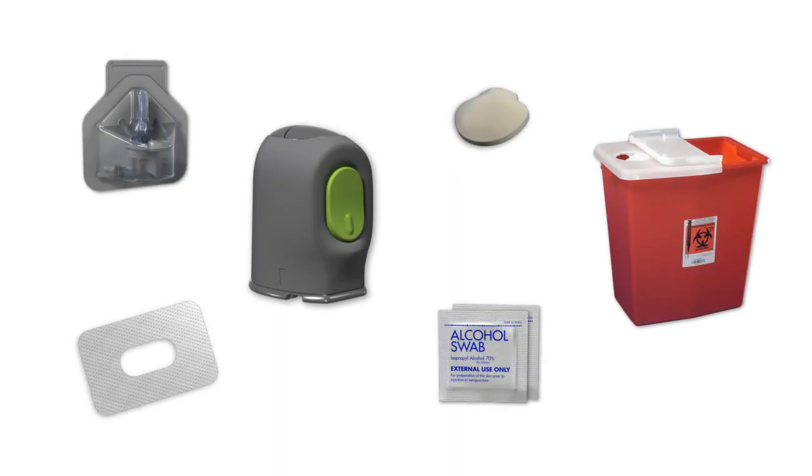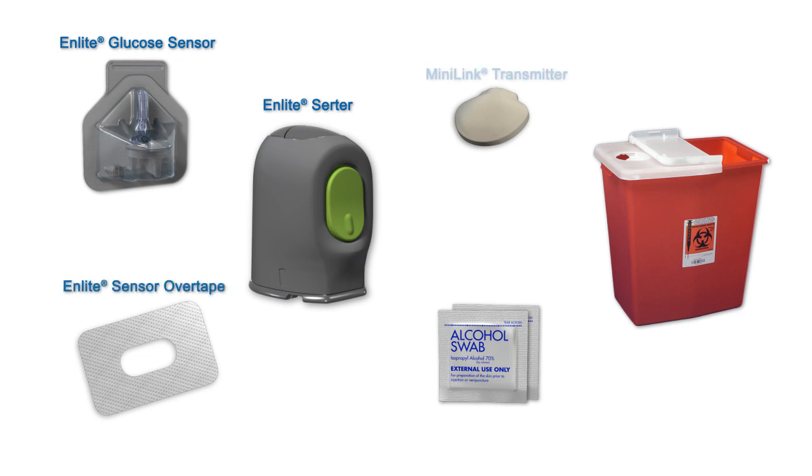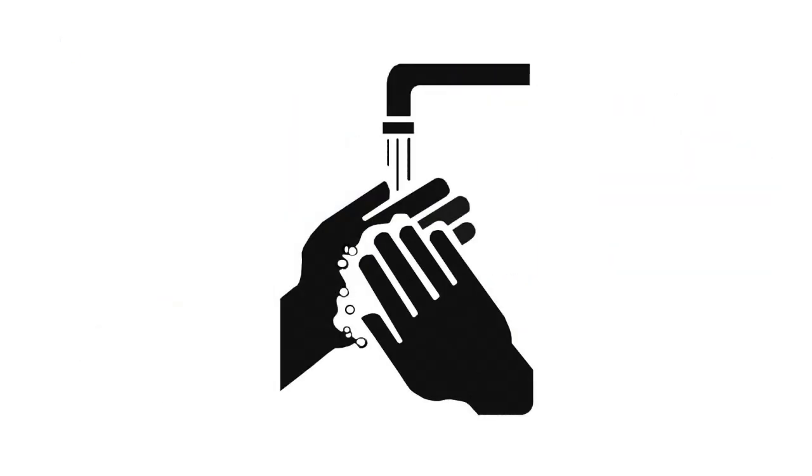When you are ready to insert your sensor, gather the following supplies: an Enlight Glucose Sensor, an Enlight Serter, Sensor Overtape, a Minilink Transmitter that has been fully charged, an Alcohol Wipe, and a Sharps Container. Wash your hands before you begin.